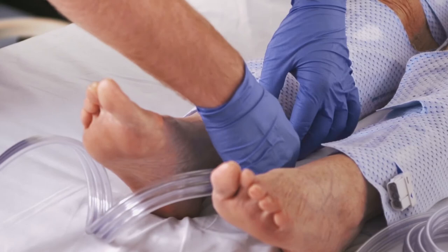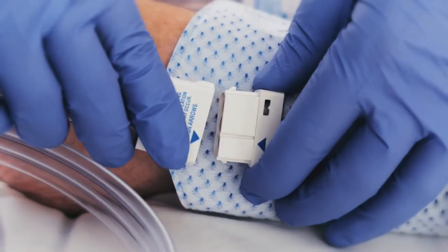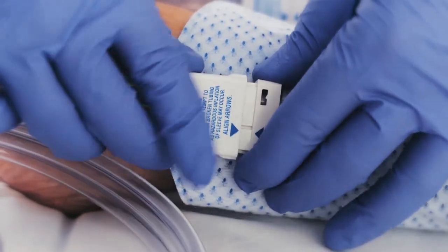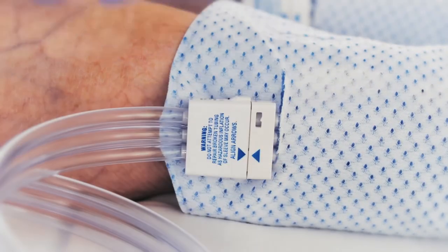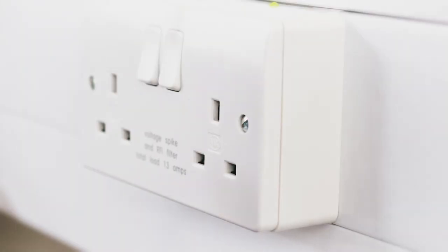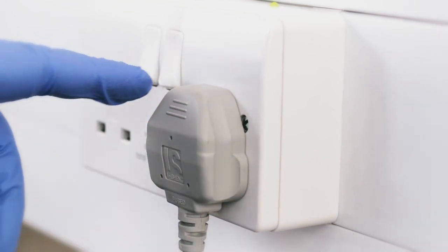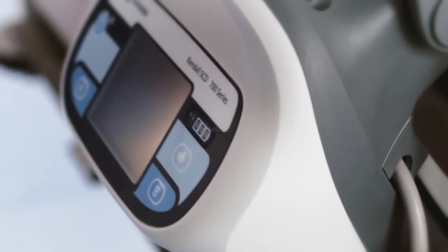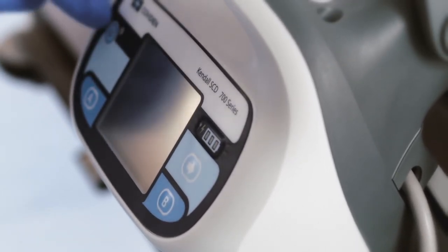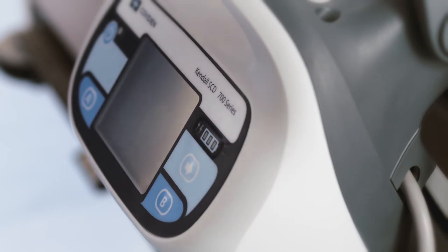Plug the tubes into the sleeves, checking for kinks and ensuring a secure attachment. Then plug the controller power cord into a properly grounded socket. If no mains power is available, the controller has a battery that will provide up to eight hours of power.